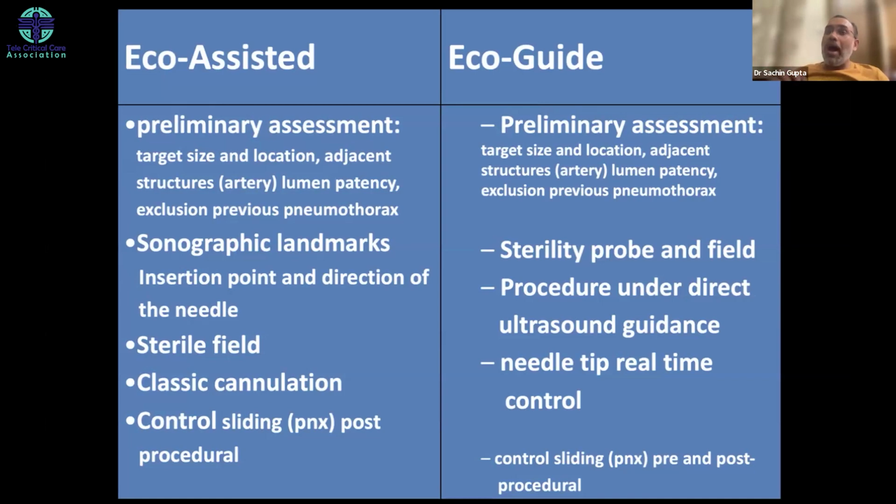Whereas echo guidance says you prepare your sterile field, but the procedure is done under ultrasound guidance, which means right from insertion into the skin to the insertion in the vein, you are visualizing the entire path of the needle. And this is what is most important.